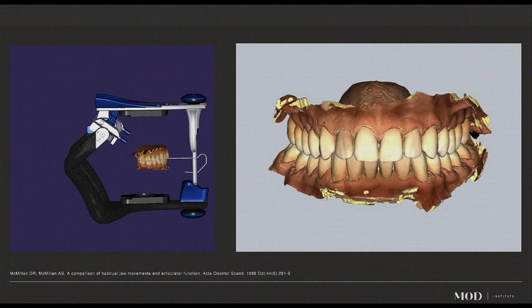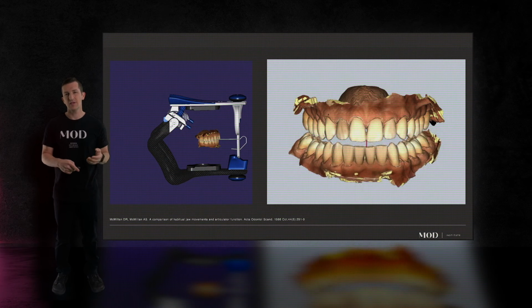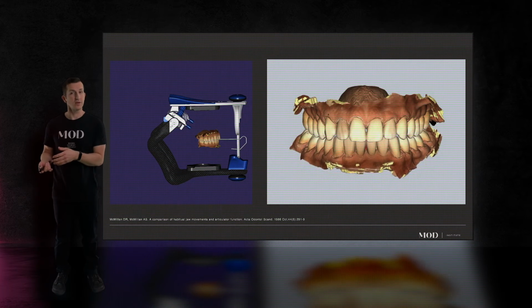The other thing that we know, whether we're planning cases digitally with an articulator or analog with an articulator, is that the border movements that we are designing with on the articulator, they don't really truly reproduce the function that we're actually seeing within our patients.